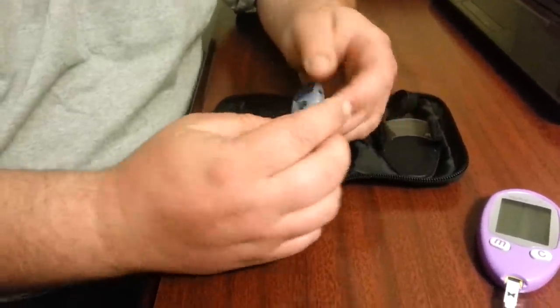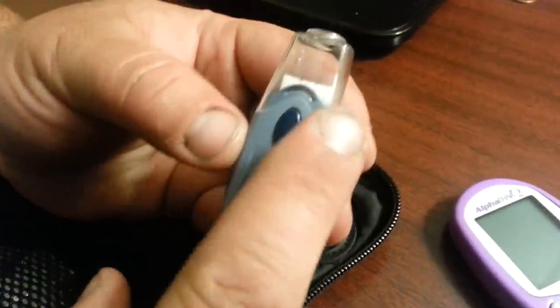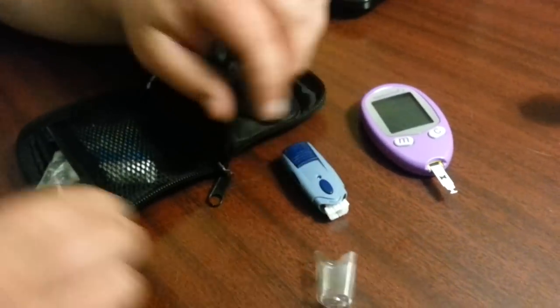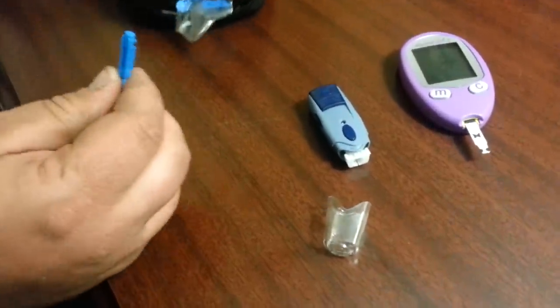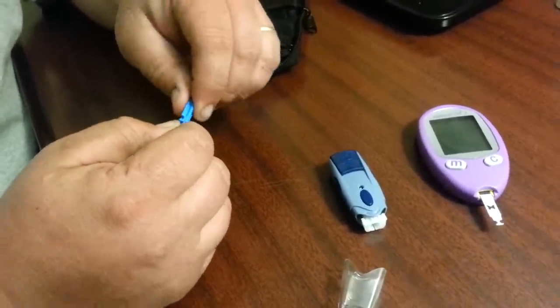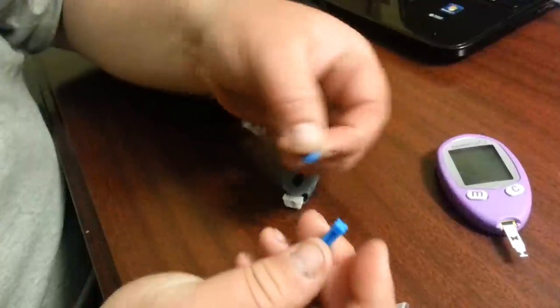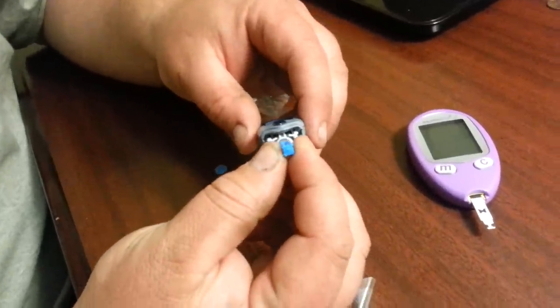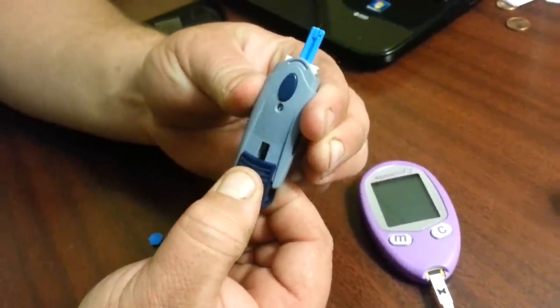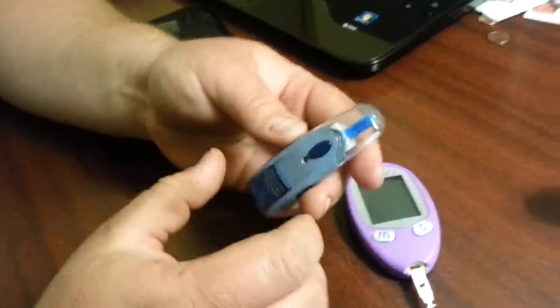Now the machine for the lancet — you'll notice on the front of it there's some numbers. The numbers simply tell you how far it's going to send out. We have it on four for the maximum punch. You open up this little cover here and take the lancet out. You take off the cap which exposes the lancet, put it down in the hole, then pull back here to cock it — you'll hear a clicking sound. Then put the cover over the top of it.